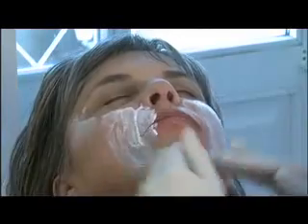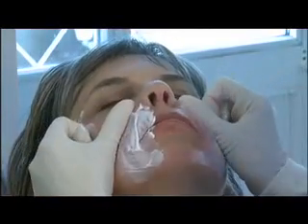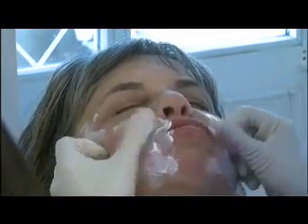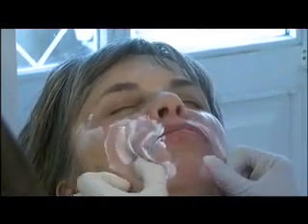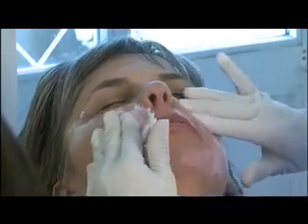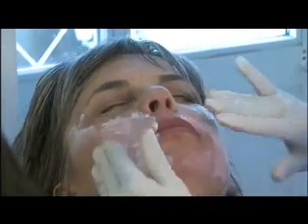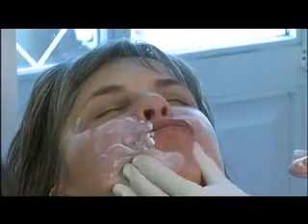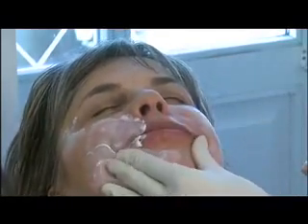After the injection, a moisturizing cream is applied in order to massage from the outside inwards for a better distribution of the product into the tissues.